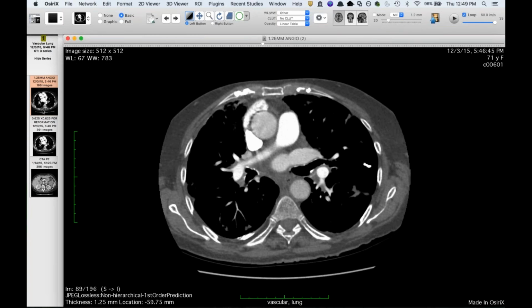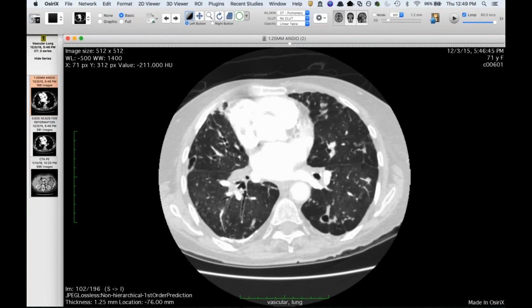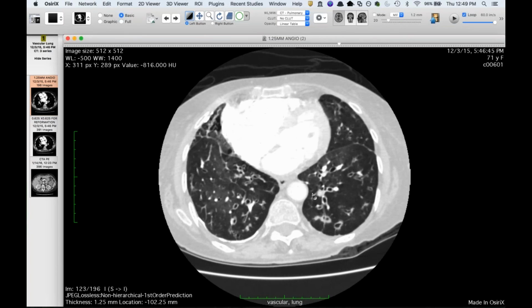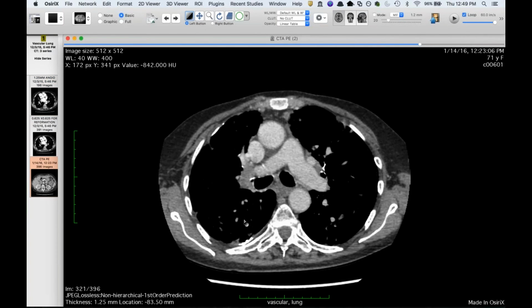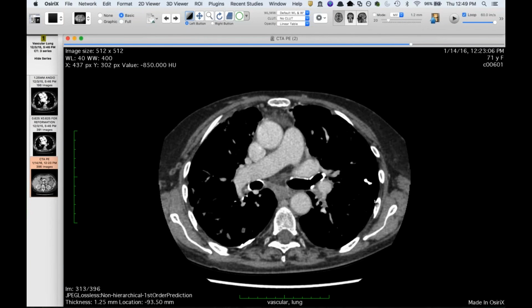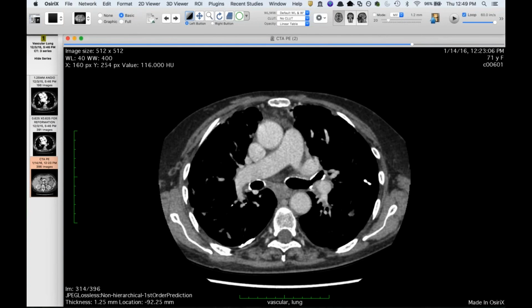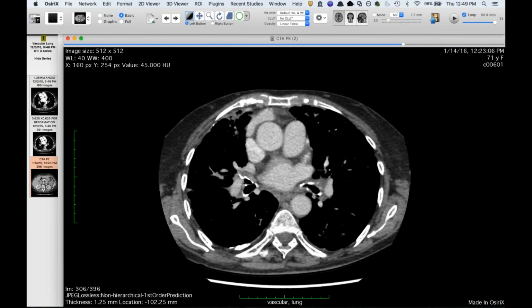So she was transferred here with a presumptive diagnosis of pulmonary embolism. Of course, she has hemoptysis, and the last thing you want to do is anticoagulate somebody that has bronchiectasis and hemoptysis. So we did a repeat, and yes, this is a month later, but more of a delayed, and you can see there's nothing there. I don't think they anticoagulated her just because of her hemoptysis, but I'm pretty confident that this was a flow-related artifact from the beginning. So I'm guessing you guys agree.